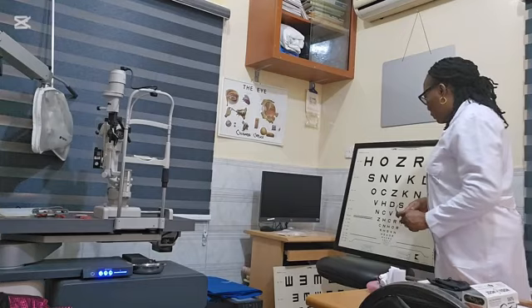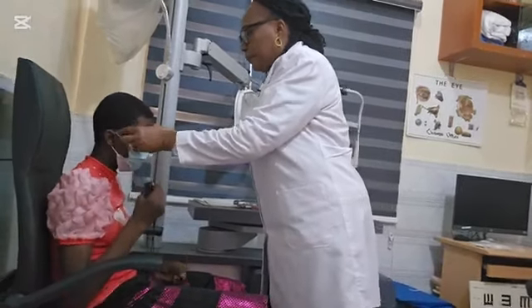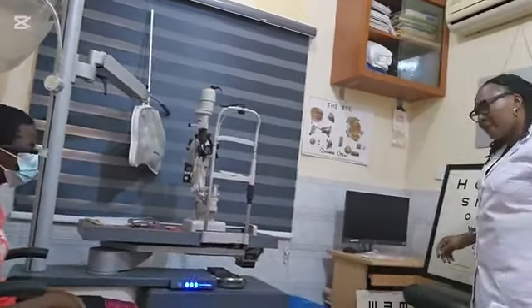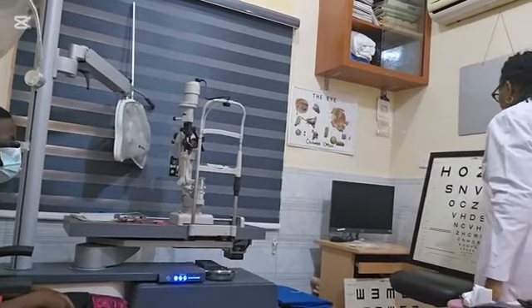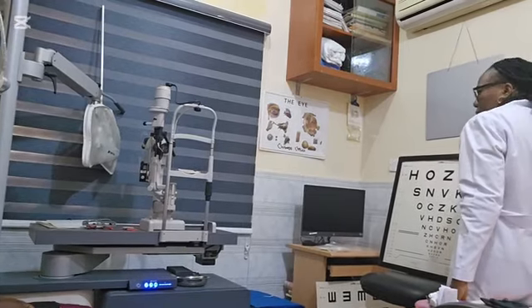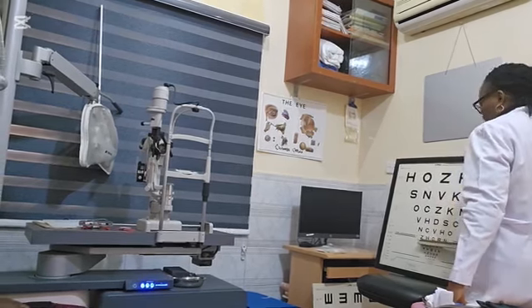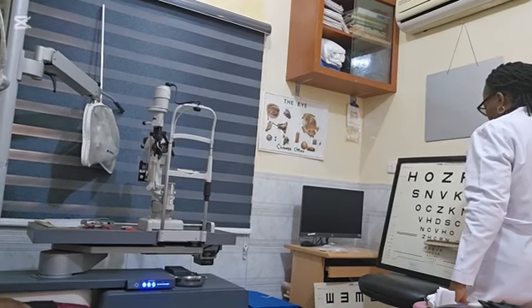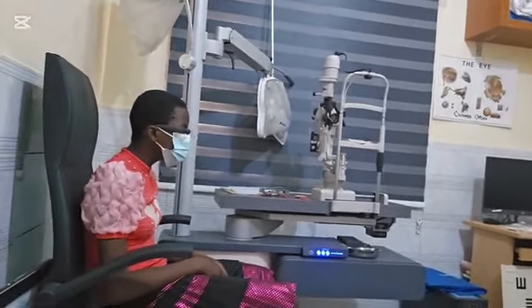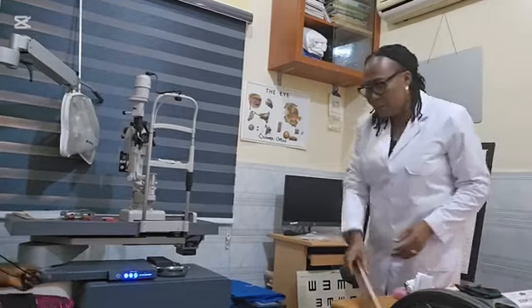And let's compare it with a 2.1x TV Max spectacle telescope. Let's see what she can read with that. Okay, that's fine. Can you read again from the beginning? H O Z R C S N V K D X, H, C R, N. Okay, with this she was able to read 0.3 logMAR.